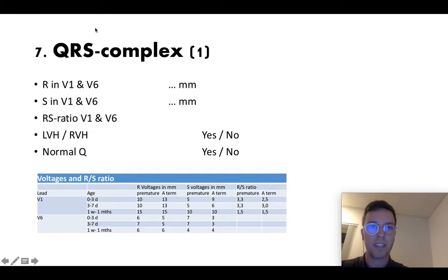Then step seven, check the QRS complex. Check the millimeters of R in V1 and V6, S in V1 and V6. Check the RS ratio between V1 and V6. Check if there is left ventricle hypertrophy or right ventricle hypertrophy. And check the aspect of Q as in the normal shape.